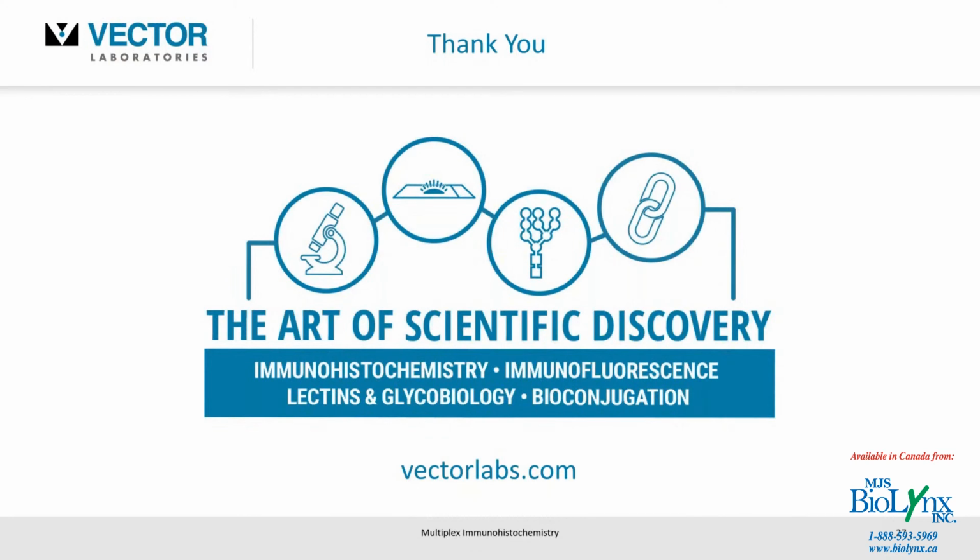Try the citrate one with a heat-resistant substrate. So you'd work all the way from unmasking primary antibody through to color development with something like a DAB, which is resistant to unmasking. Then you could go back and unmask with the EDTA, for example, or tris pH 9 unmasking if that target antigen requires that in the primary antibody, and then develop for that second color.